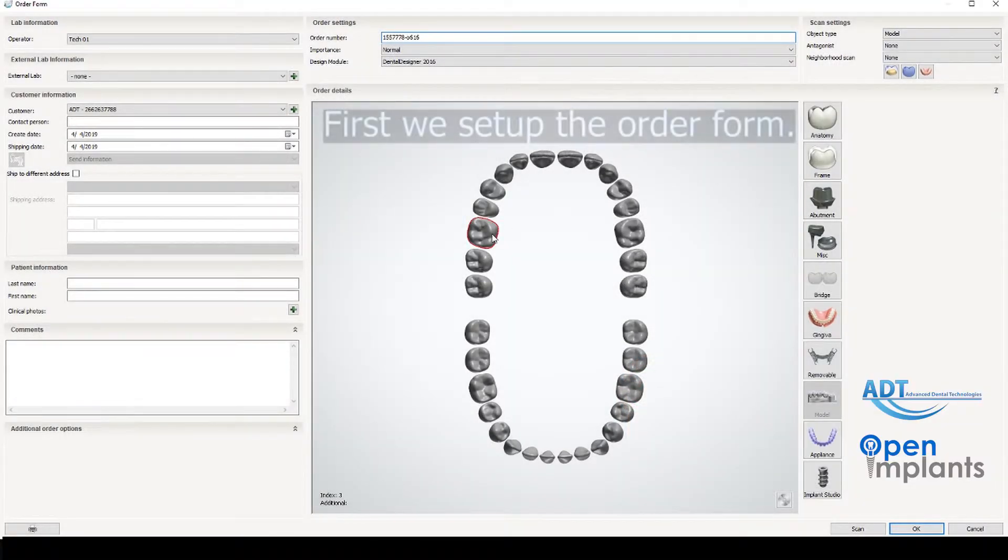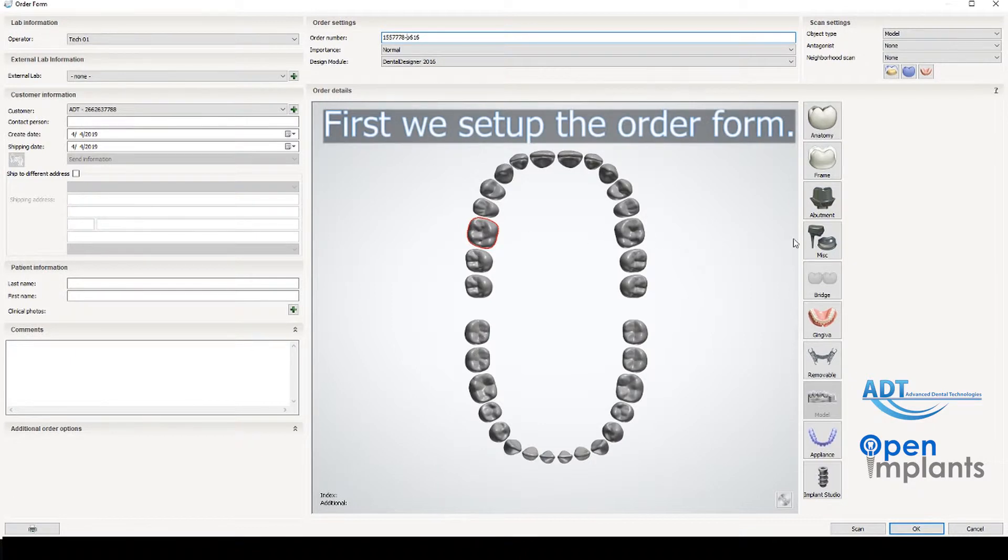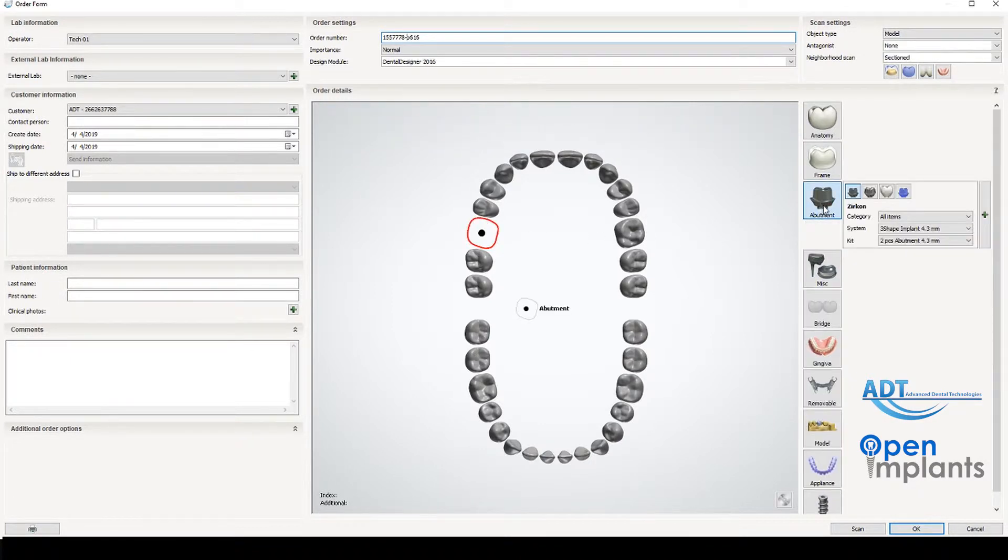First we start at the order form. We are doing a screw retain crown so we select that under abutment.